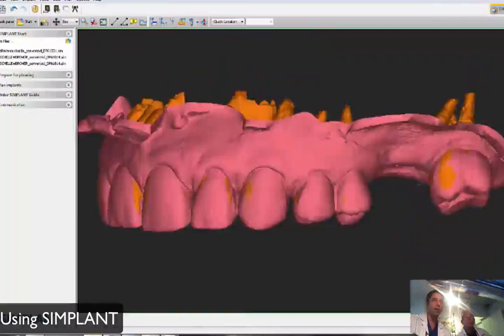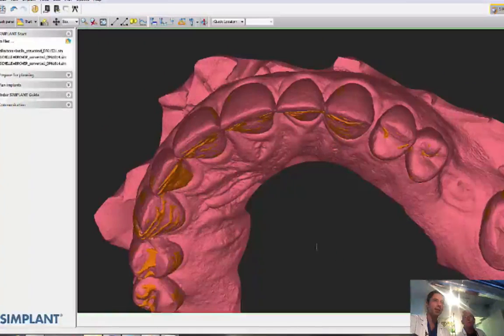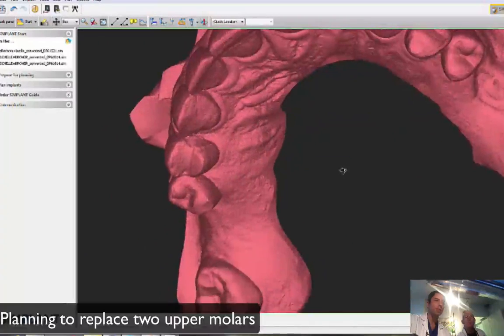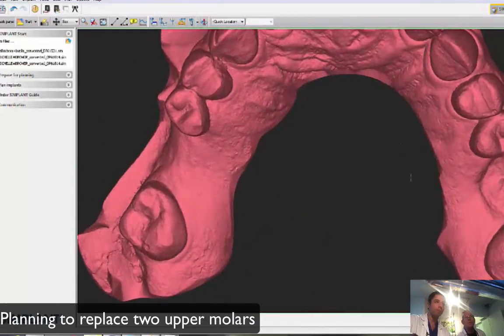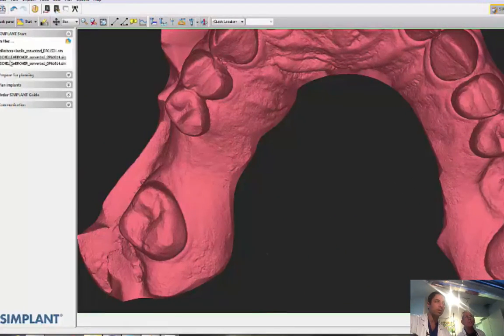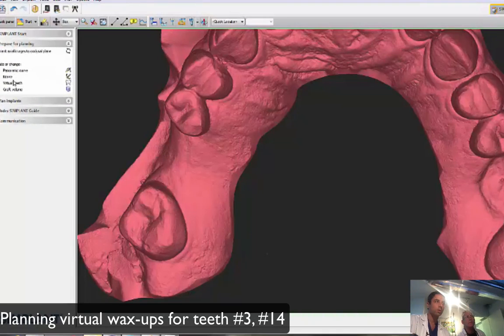This is a different story. We have the iTero, but now we're replacing two upper molars. We don't need to map a nerve obviously, but we still need to do a virtual wax-up.